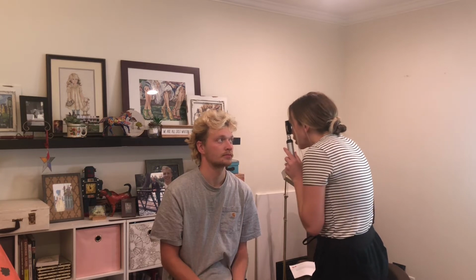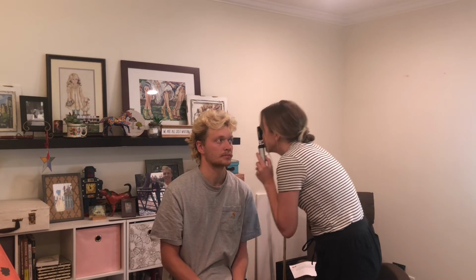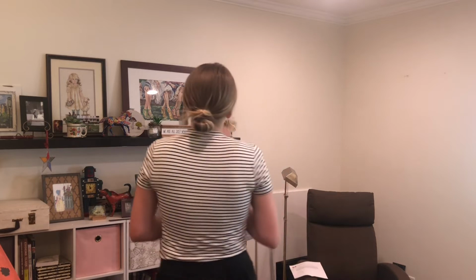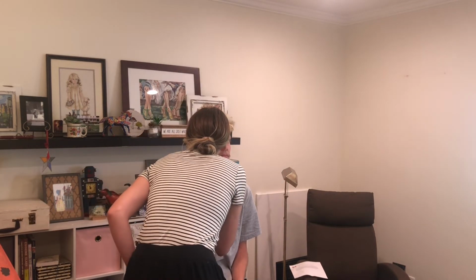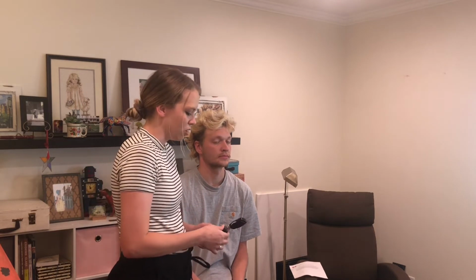The last part of the eye exam is with our ophthalmoscope. So we'll start with the ophthalmoscope about 10 inches away, and I'll use my left eye to look at his left eye and my left hand. And here we're looking at the retina as well as for the optic disc, the blood vessels, the macula, and the fovea. And the same thing on this side. All of those are visualized and look normal.